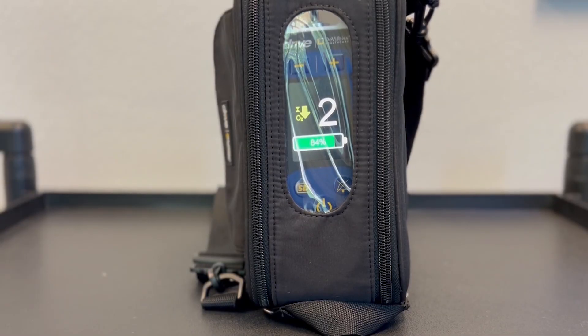While using the carrying case, you still have full visibility and access to all of your controls.